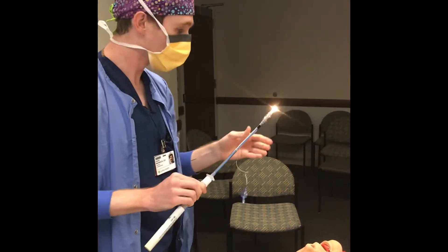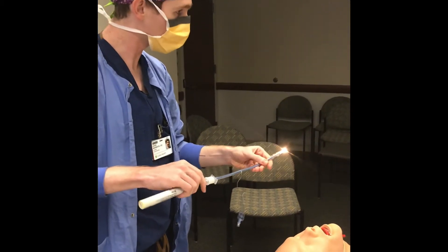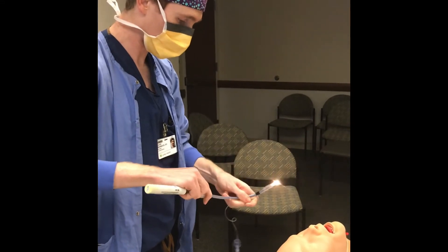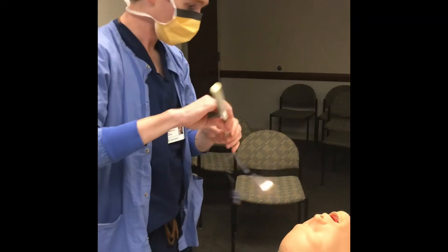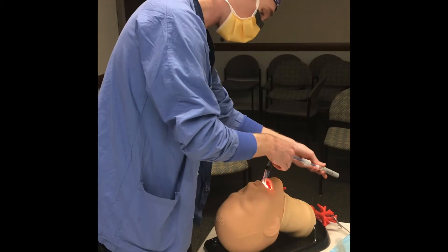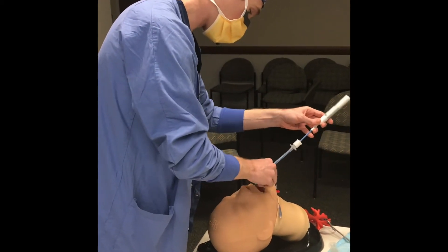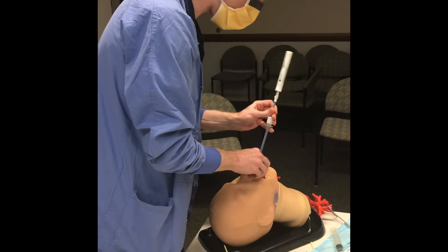When creating the shape, you want to make a hyper-angulated curve, almost like your GlideScope blade. Just like placing the GlideScope, you follow the curve of the mouth. Again, it's a blind procedure — you get it into that space and kind of tilt it back in.